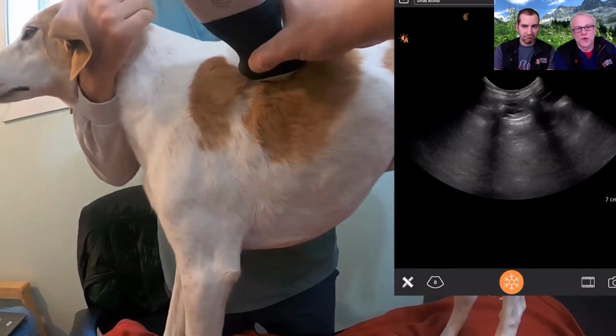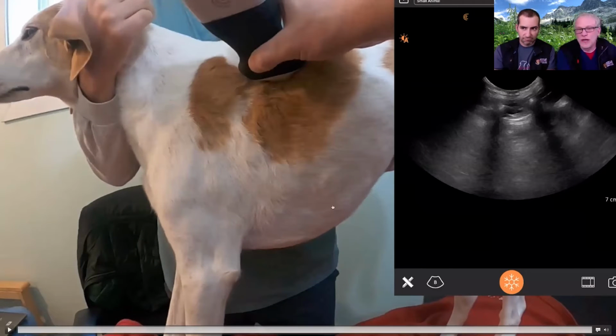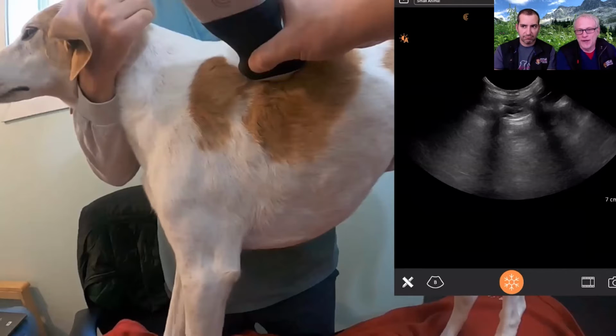All right, Dr. Chalhoub. So we went caudal, we went dorsal. That's really, really quick and easy to do. Very nice, Dr. Chalhoub.